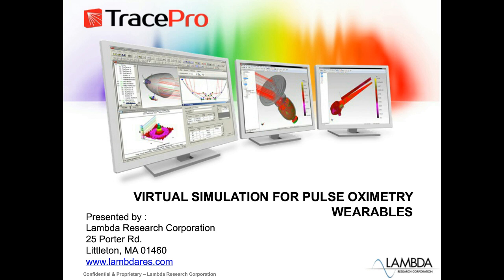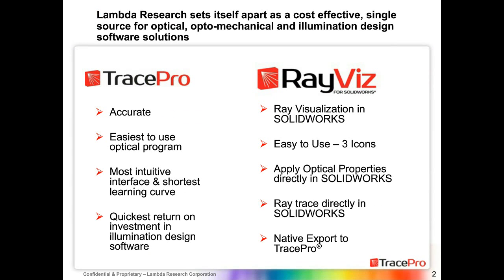I'm going to flip you over to our slide and introduce you to a little bit about Lambda Research. Lambda Research has been in business for over 20 years, and we set ourselves apart by offering cost-effective, single-source, optical, optomechanical, and illumination design software solutions.